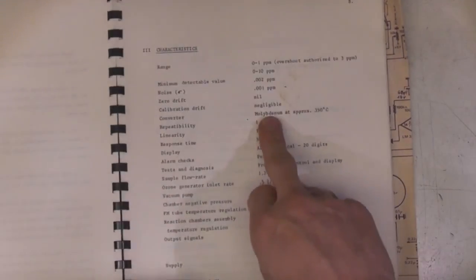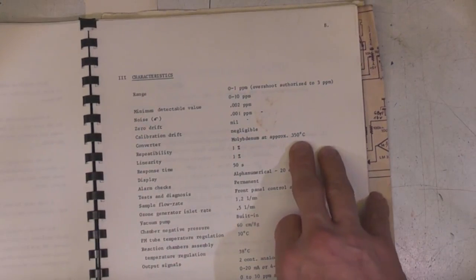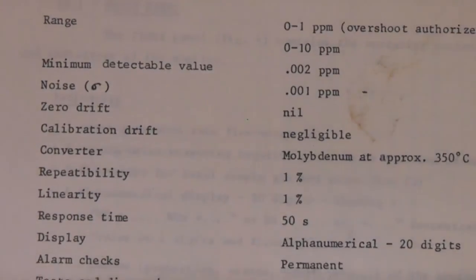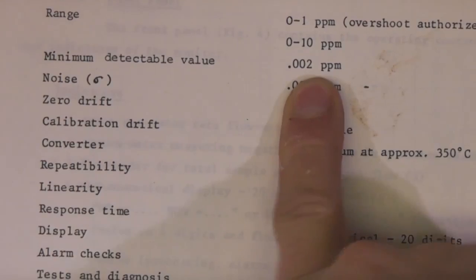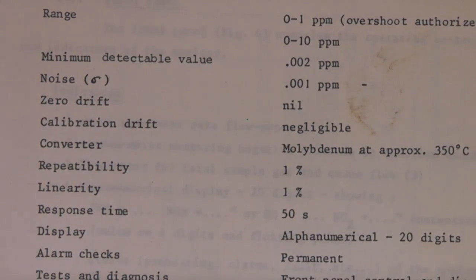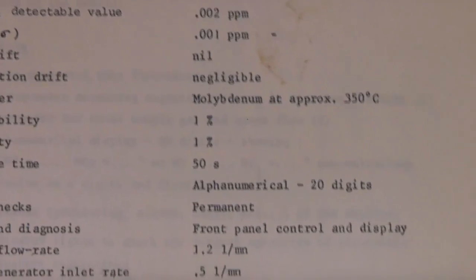This is the molybdenum converter - a catalyst running at 350 degrees C. This is very very sensitive and can actually detect 0.002 ppm - parts per million - so that's sort of two parts per billion. That's an extremely sensitive piece of equipment.